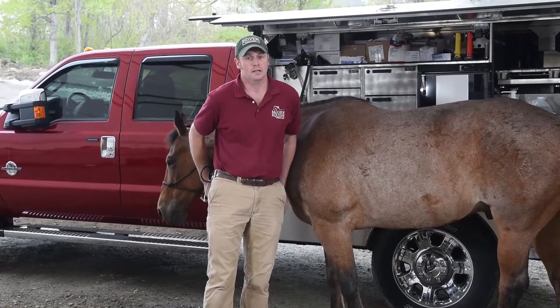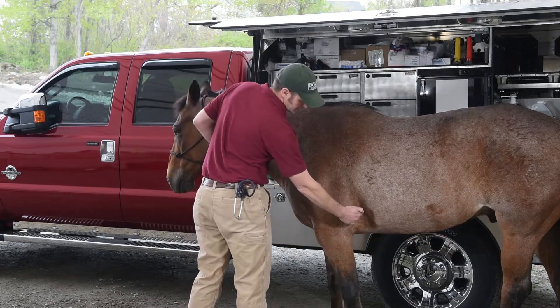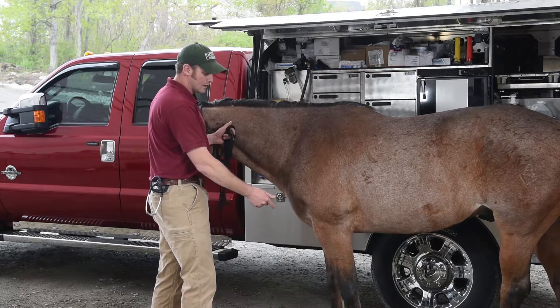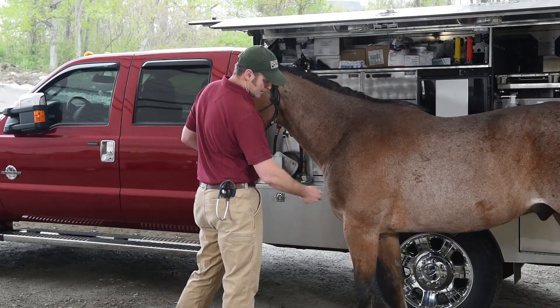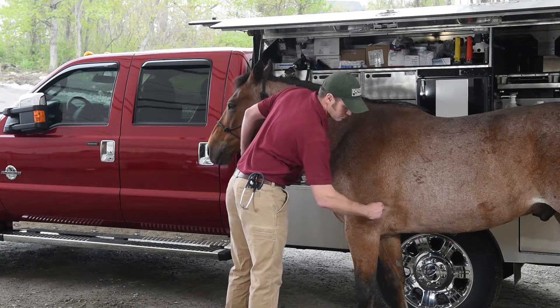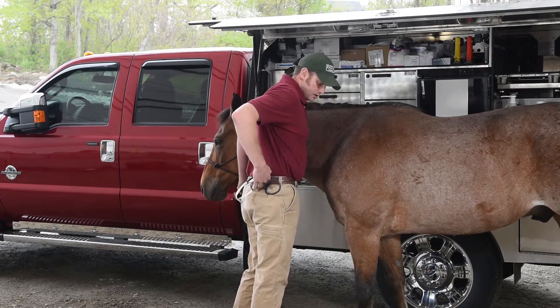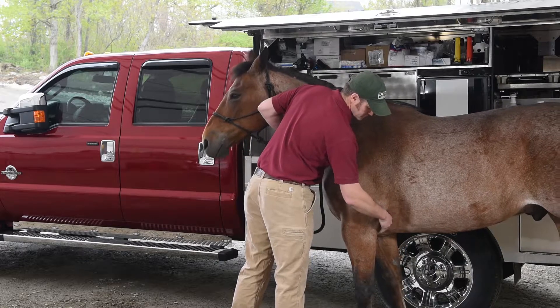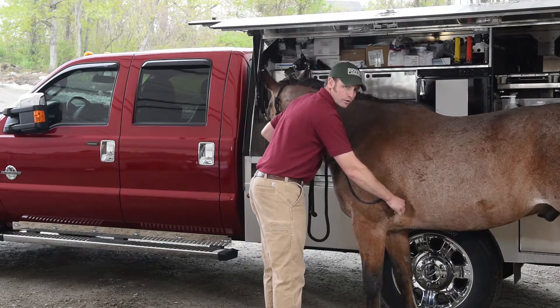Probably the easiest and most reliable place to get a heart rate on them is, if you have a stethoscope, listening right here and putting the bell of the stethoscope underneath their elbow. Now if you see how Wyatt's standing, he's got that left front tucked back a little bit, which can make it pretty difficult to hear his heart rate. A lot of times I'll have him step back so that left front is out a bit more, so the point of his elbow isn't blocking that window over his ribcage. Don't be bashful — actually take the bell of the stethoscope and wedge it right in underneath his elbow if you have to. Sometimes it'll get a little ticklish at first, but right there is where you're going to hear it, and you might have to fish around a little bit.